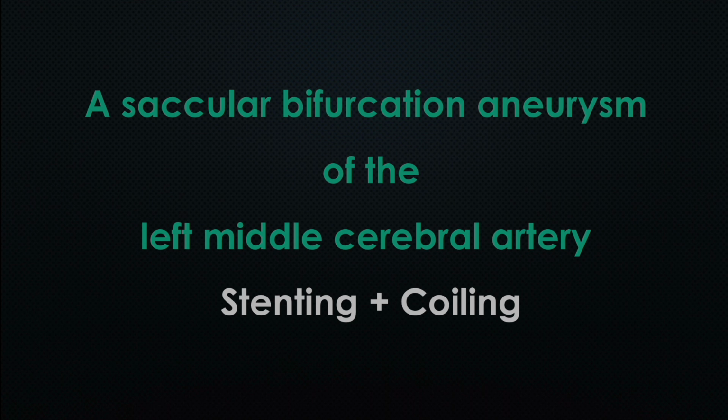My name is Al-Mohammed, and today we have a saccular bifurcation aneurysm of the left middle cerebral artery, which we've treated with permanent stenting and coiling. It was a 67 years old female patient with no neurological deficits. She had 3 incidental aneurysms, 2 on the right side, distal ICA and media bifurcation aneurysms, which are already treated, and today we will treat the left media bifurcation aneurysm.